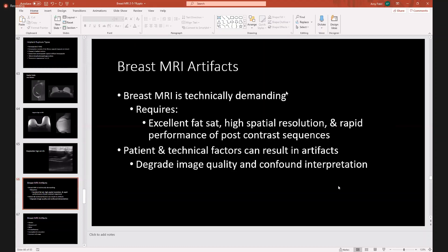Breast MRI is technically demanding, and we know that. It requires excellent fat saturation, high spatial resolution, and rapid performance of post-contrast sequences. Patient and technical factors can result in artifacts and degrade image quality and confound interpretation. So it's really important to have the exemplary technical parameters in place to have a really good breast MRI.